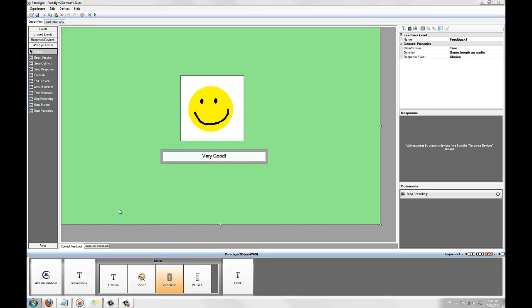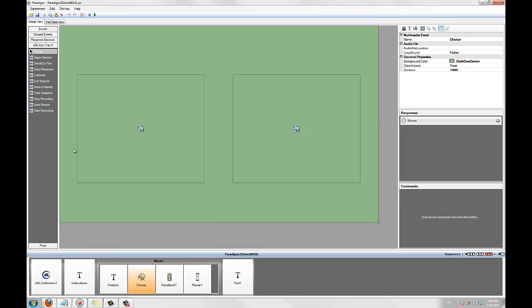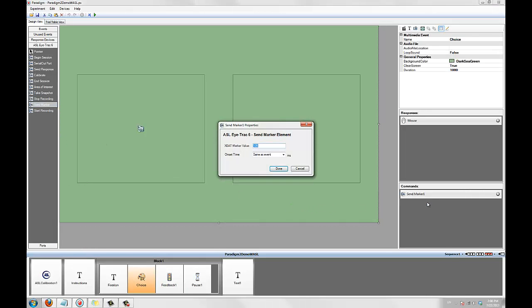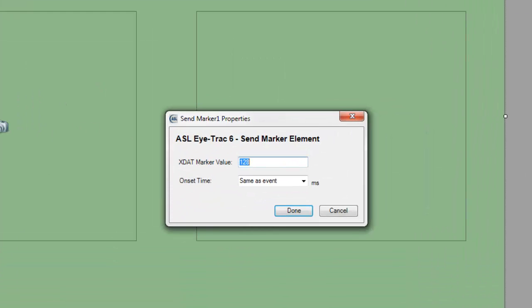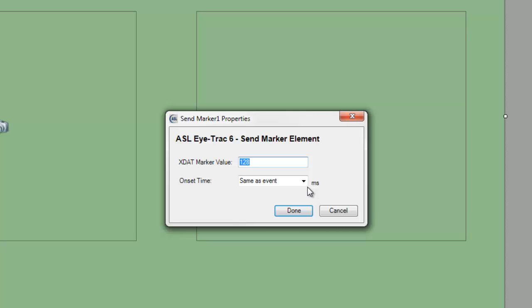Next, we'll use the sendMarker element to send an XDAT marker at the onset of each stimulus. To do that, we'll add a sendMarker element to the choiceEvents command area. We'll leave the XDAT marker value for now as we are going to change that with each trial using a connection. An interesting thing to note here is the onsetTime property. This allows you to specify at what point during this event the XDAT marker should be sent. The default is same as event, which means the XDAT will be synchronized with the stimulus onset.